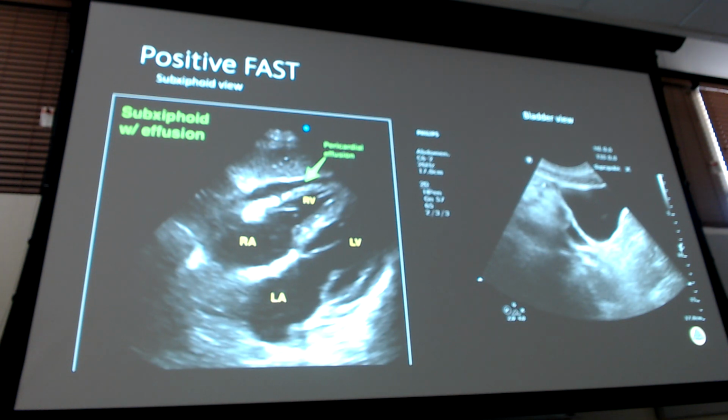This is one of the few cases where I would say you don't have to use Radiopaedia. Google is completely appropriate to look for abnormal EFAST images. That's actually one of the few things that it's really good at. X-rays, there's a lot to interpret, but for this, no pun intended, it's pretty black and white on whether it's abnormal or normal for EFAST. So Google is a safe bet when looking for normal versus abnormal EFAST, if you're interested in doing that. There's not much gray area for interpretation.